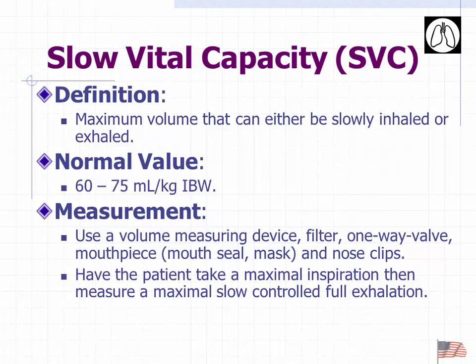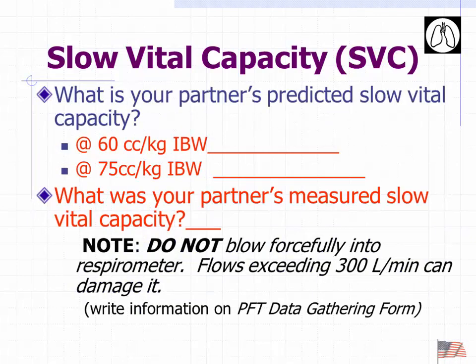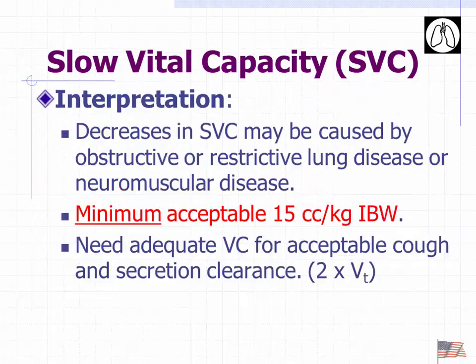And how would we instruct the patient to do a slow vital capacity? Take a deep breath in, deep, deep, deep. Keep it going, go, go, go. Now blow it out nice and slow. Push, push, squeeze, squeeze. Keep going, go, go, go. All the way out, all the way out. You don't have to do that part, but not forcefully. That's why it's called a slow vital capacity.